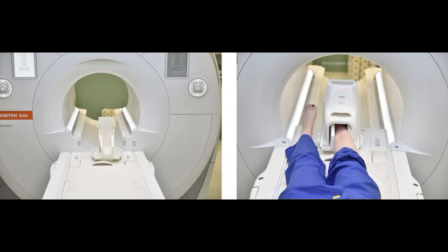First, let's start with the patient positioning. Position the patient in the supine position with feet pointing towards the magnet. The position will be feet-first supine, and place the ankle joint on the ankle and foot coil. The ankle should be at a 90-degree angle. If the ankle foot coil is not available, you can use the knee coil. Center the laser beam on the ankle joint.